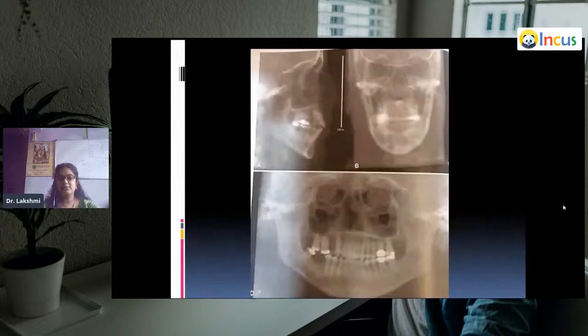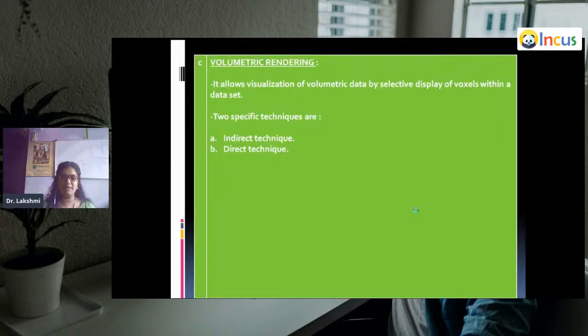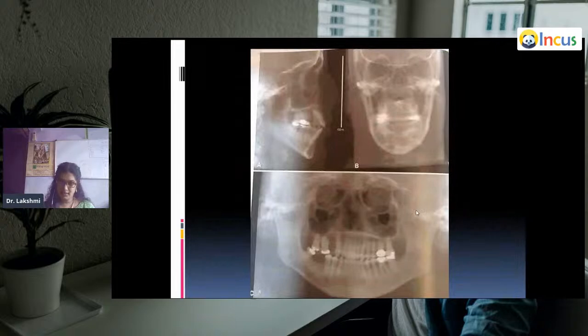Okay, see this one. In all the three planes, okay, in all the three images, the image noise is more. Here also, it seems that some structure is overlapping, or maybe like a double image is being formed. The same thing here, okay, and in this area as well, because usually in panoramic, they tend to overlap certain structures as well. So Raysum images, wherein we are actually adding the slice thickness or the volume to the already existing data, such problems tend to occur.